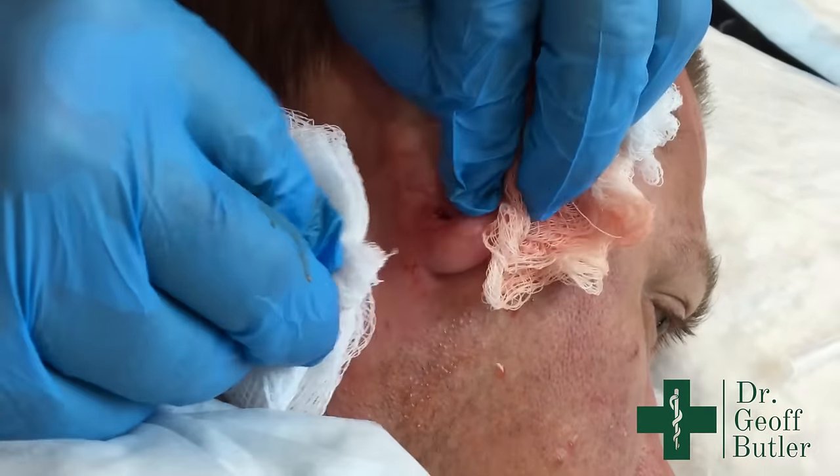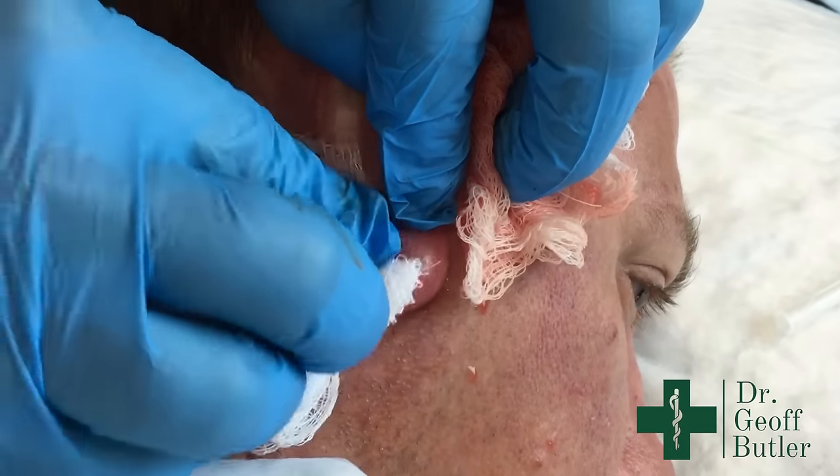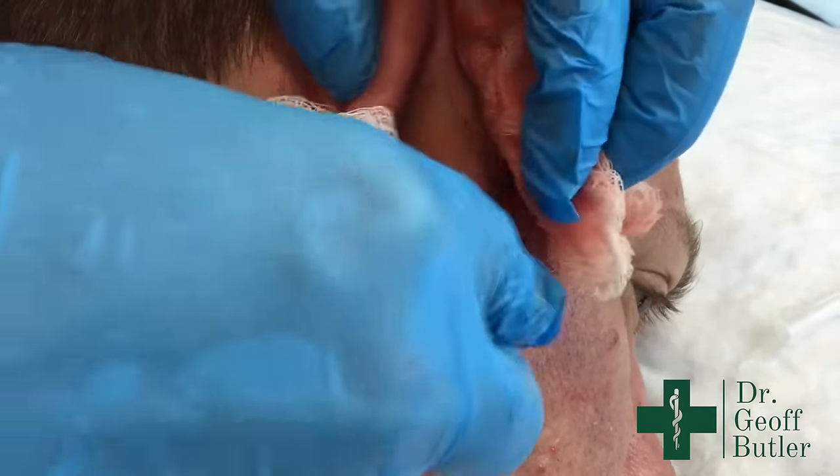We'll let that heal and see whether there's a cyst we can go after afterwards to get the capsule out. Looking at it now, there's no real capsule to go after — you can't see any margins of any kind in there. We'll seal that up with a dressing and that should be it — all done.